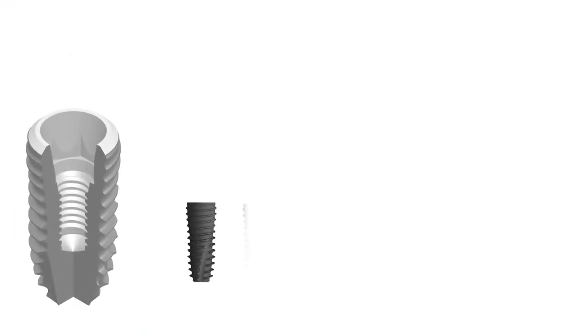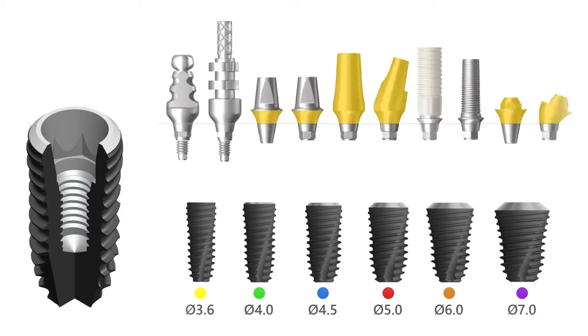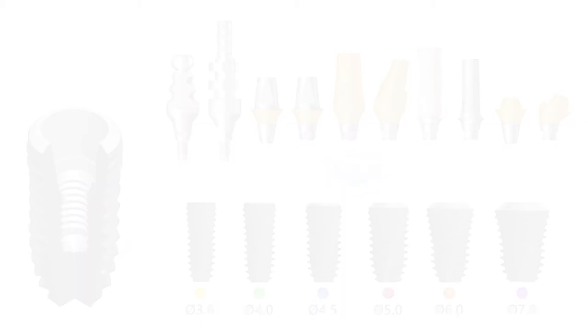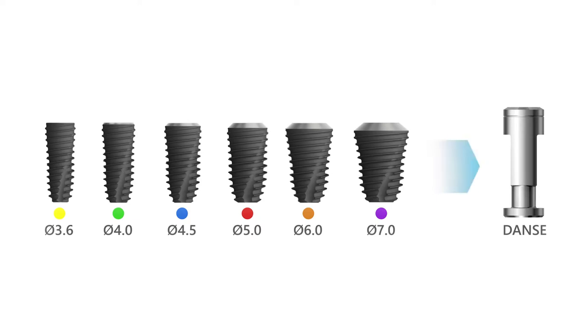The implant interface is common across all lengths and diameters of the implants in the SuperLine2 product line, so the restorative clinician can be confident that all impression and prosthetic components will fit into each implant, no matter the implant size. In addition, there is only one implant analog to choose from the catalog, which is universal and is used for all implants in the entire SuperLine2 product lineup.